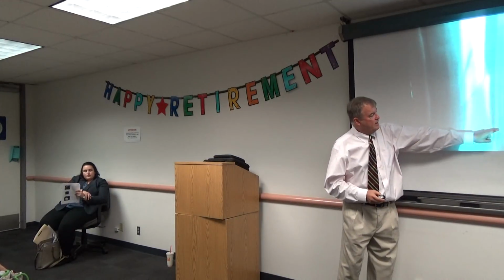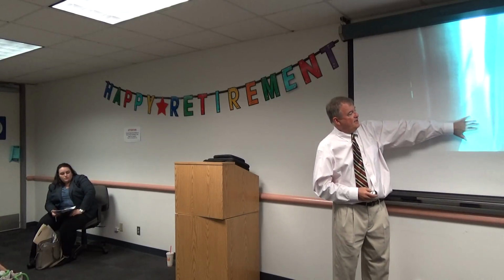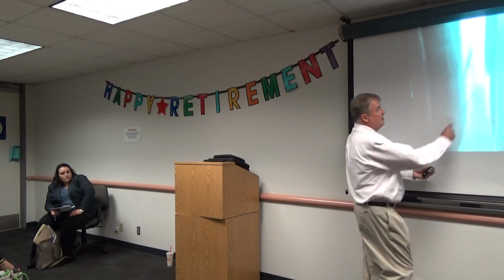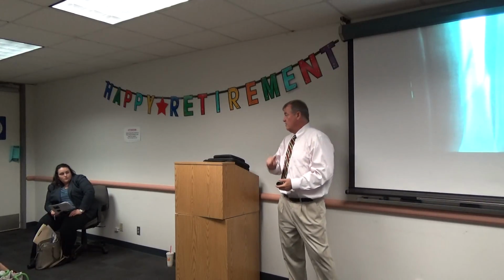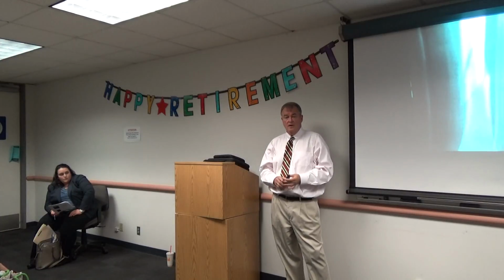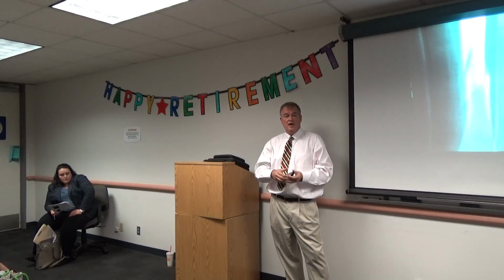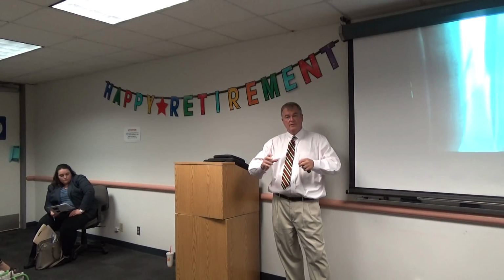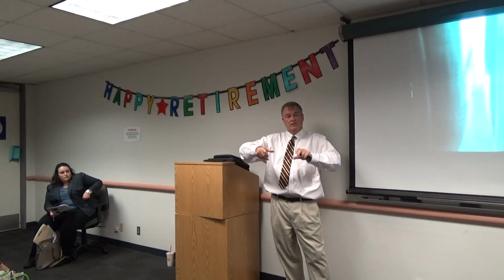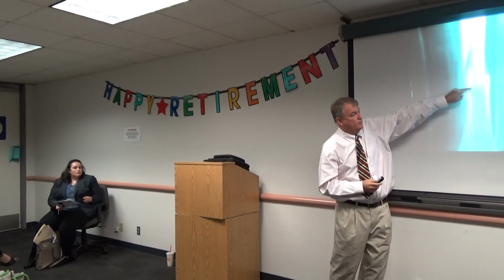This is the tibia, and this is the fibula. I'm testing myself. That's the tibia. And then this, it looks like two lines, but it's not two lines. It's a spiral, just like a barber pole. The way you can think of it is the cardboard tube that's inside a roll of paper towel. Next time you finish that roll of paper towel, take the cardboard tube and twist it, and you'll see the spiral open up, and it looks just like this as it opens up.